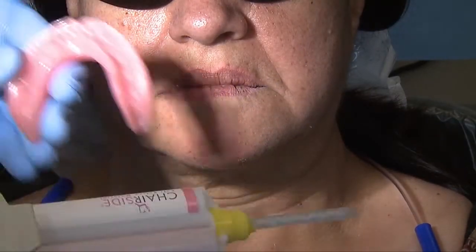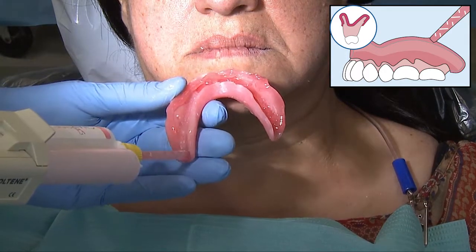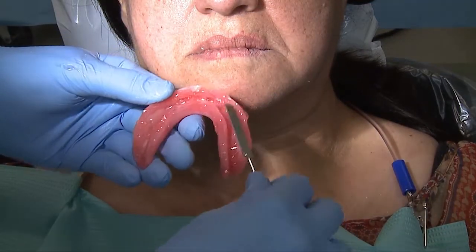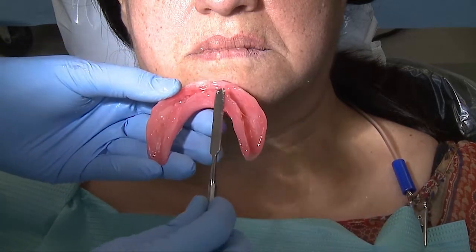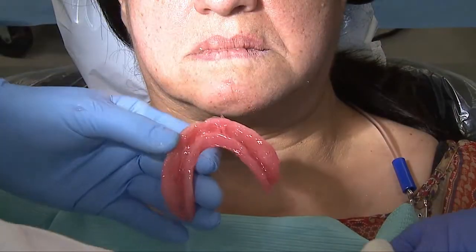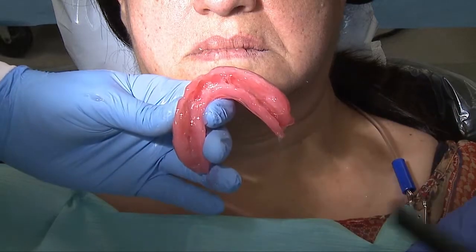I'm going to take my chair side soft material and inject it into this area, filling the inside and rolling along my borders and periphery. Depending on your desired clinical technique, some people like to roll along the borders first. I like to go ahead and fill in some of these areas. I don't need a whole lot of soft material in the posterior, so I'll fill in a bunch in the anterior right around where those holes are, rolling along my lingual borders, then touch it up with a little bit more border molding for a nice border seal. Now we're ready for placement in the mouth.